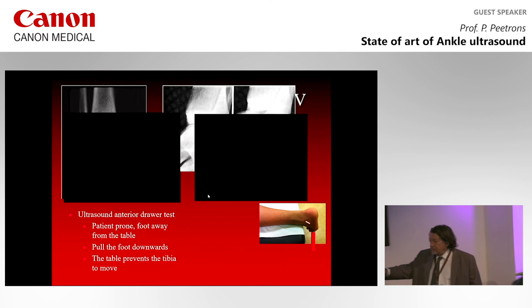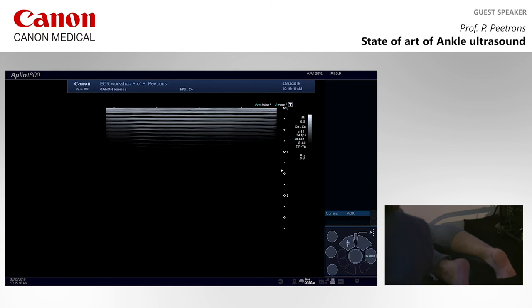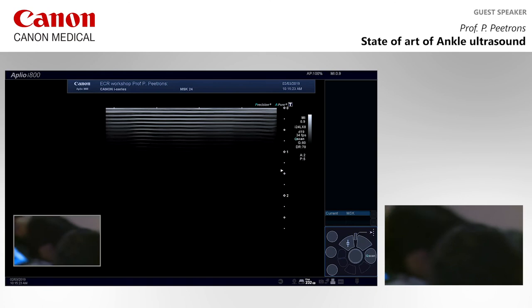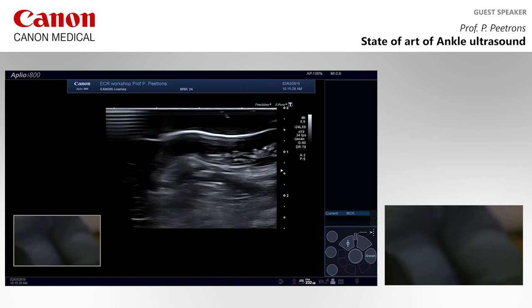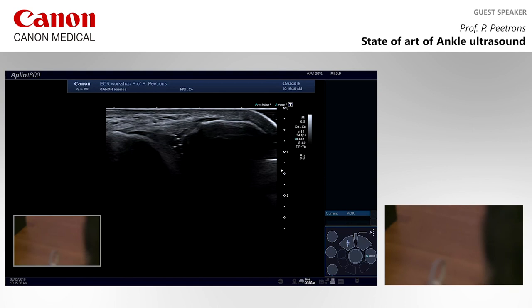I take this one. So I take a high frequency probe, which is big. We can also take the hockey stick probe. I put his tibia on the table. I put my probe, I will do this one so you can see a little bit better. I put my probe on the ATFL.